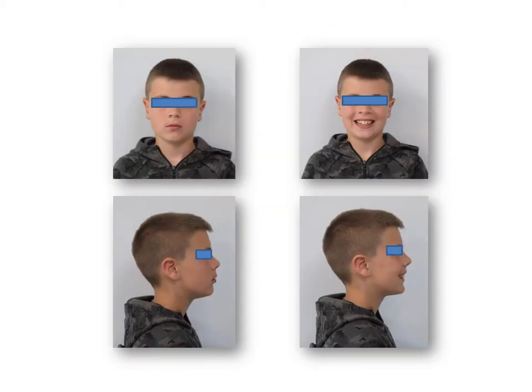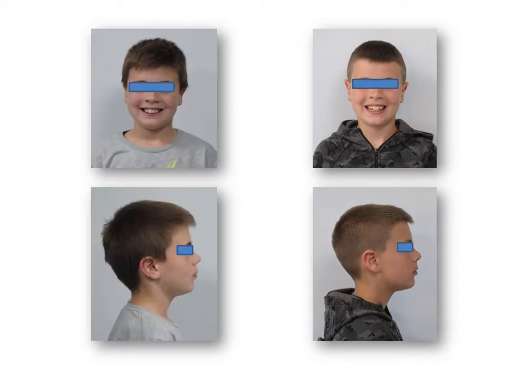These are the extraoral changes for this period of treatment of 9 months, especially in the lips and the profile. And in these pictures you can compare before and after the treatment with the twin block: the wider smile, the inclination of the incisors, and the change in the profile.